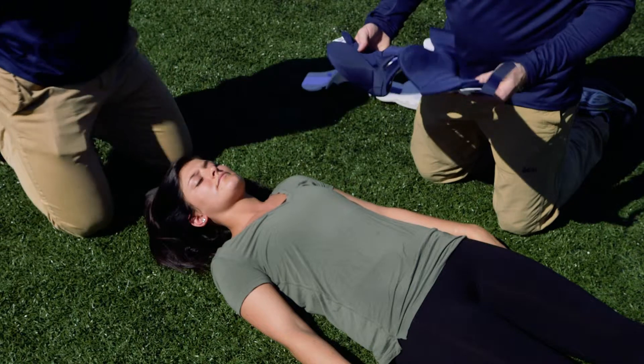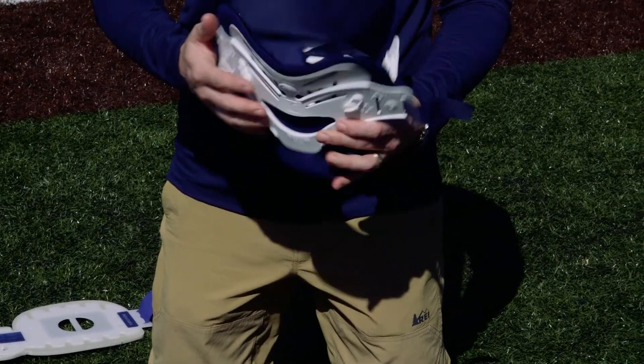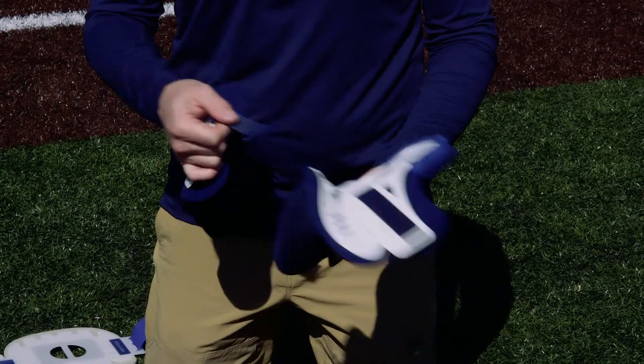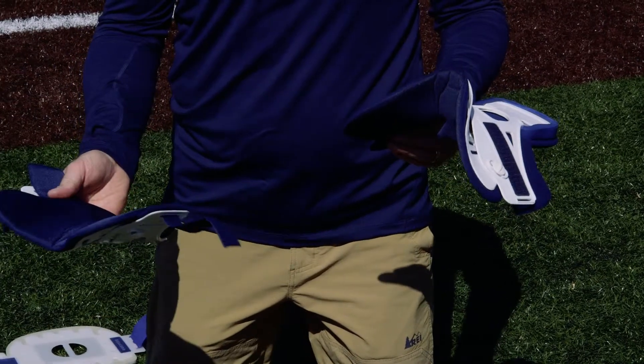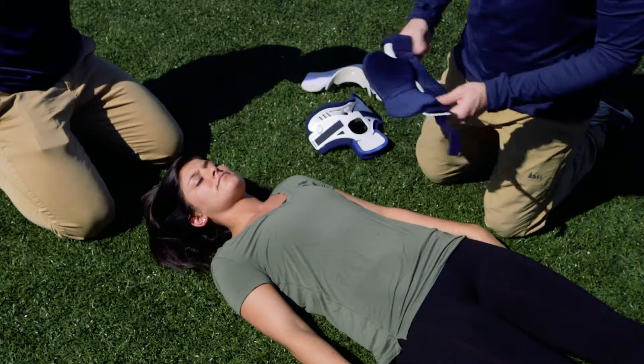This particular collar is the one I'm going to actually fit. It has a front and a back, so you want to make sure you're placing those correctly. What I like about this one is it allows you to separate the two pieces, sliding the back piece on first and then directly applying the front piece over the front of the neck.